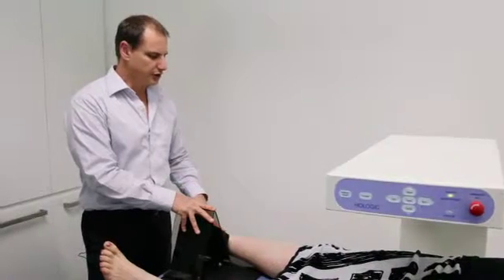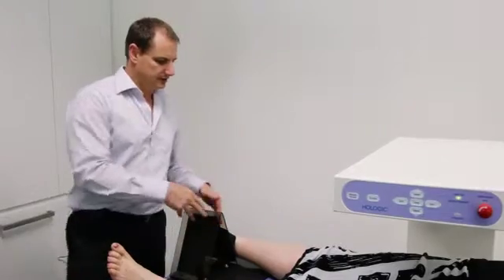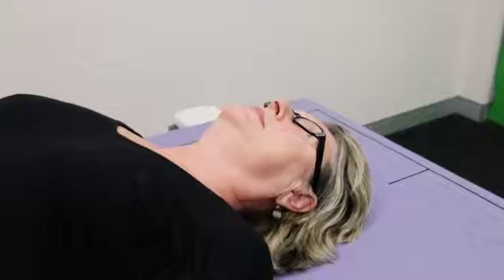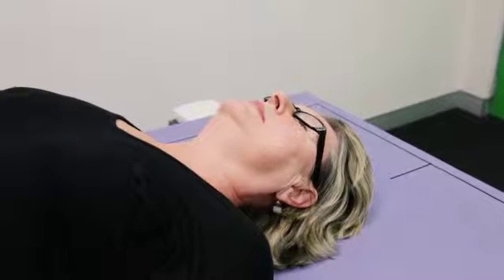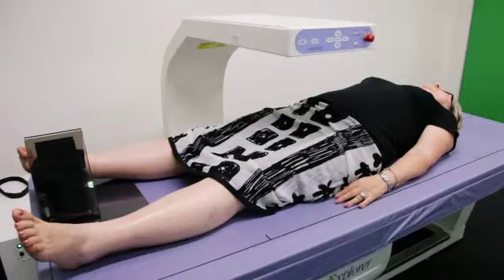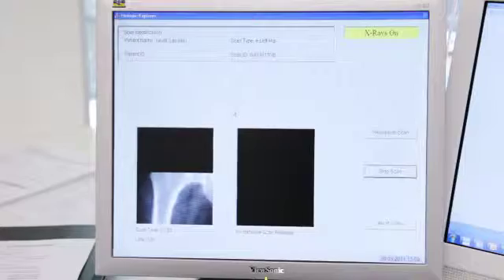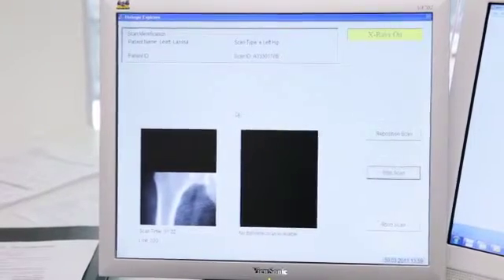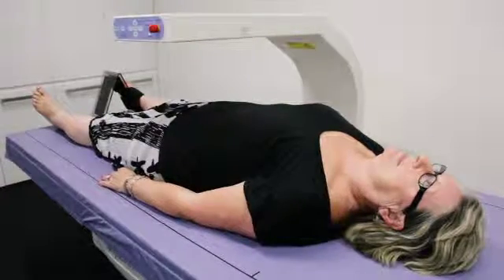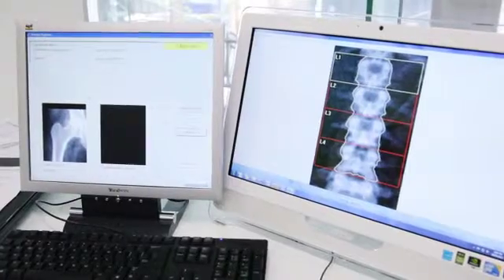The second scan we're going to do is just on the femoral neck. So that's where the femur actually joins into the hip, and this scan will take approximately 1 minute. If you've had a hip replacement on your left hip, the technician will do the right hip. If both hips have been replaced, the technician will do a forearm instead. There is always a way around so that at least we can get 2 pictures to send back to your doctor.